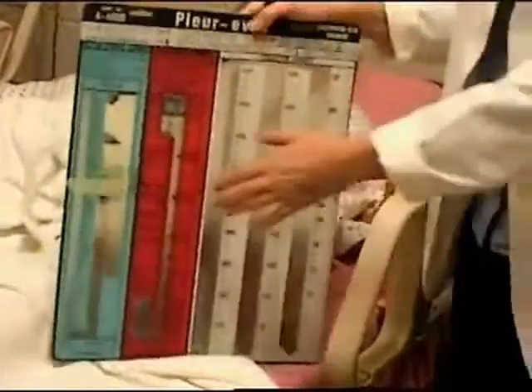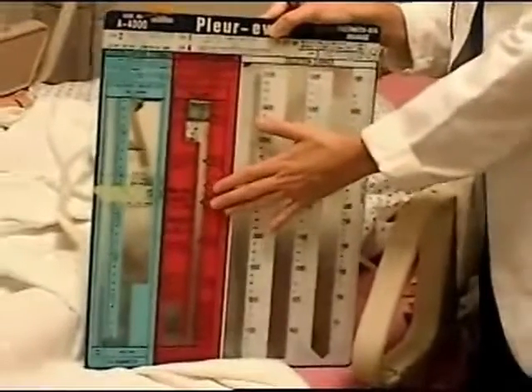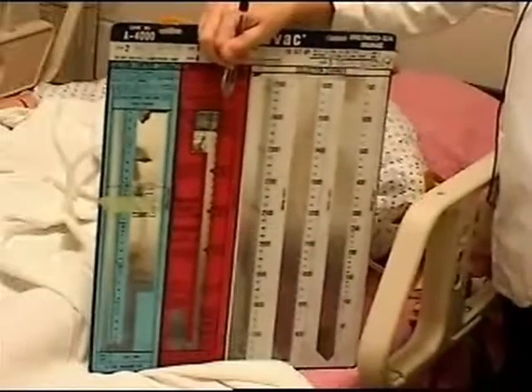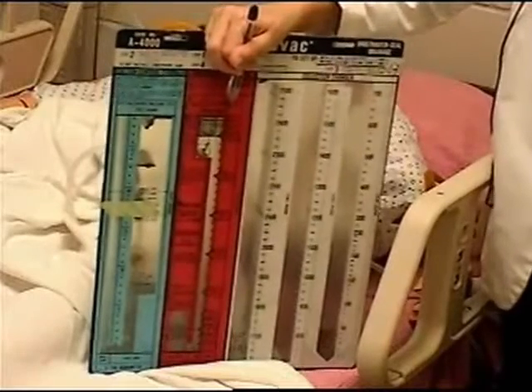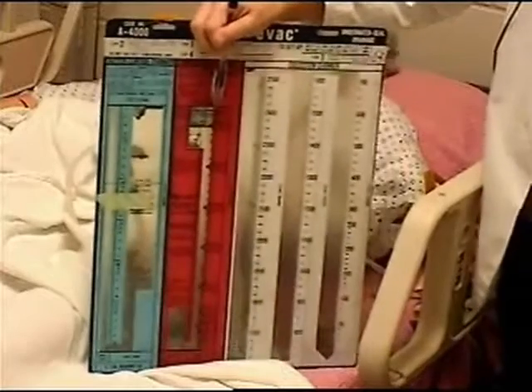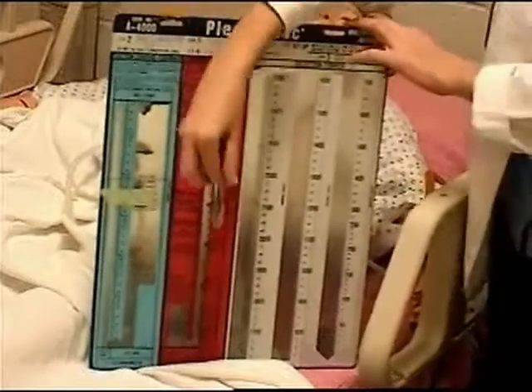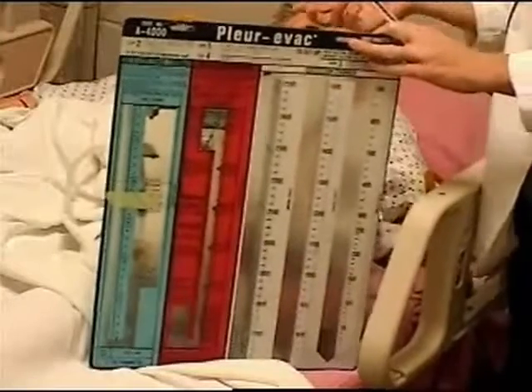You can have some gentle bubbling in the suction, that is okay, but continuous bubbling in the water seal is not okay. What the water seal does is it allows for air to go out of the chest cavity when the patient exhales, but when they inhale, it stops it and doesn't allow for air to go into the cavity, and we don't want air to be going into that thoracic cavity. So if there's continuous bubbling on here, then it's something that gets assessed.